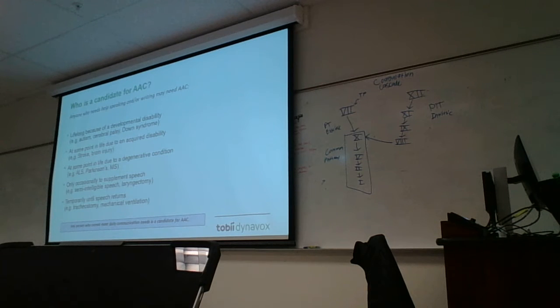And then, some people just need to occasionally supplement their speech, as well as temporary speech impediments or impairments. So it depends on the severity of the person's disability, and that's something that's considered and a part of that evaluation process, an evaluation report that gets submitted to insurance as well. And we'll talk about what the funding process entails as well.